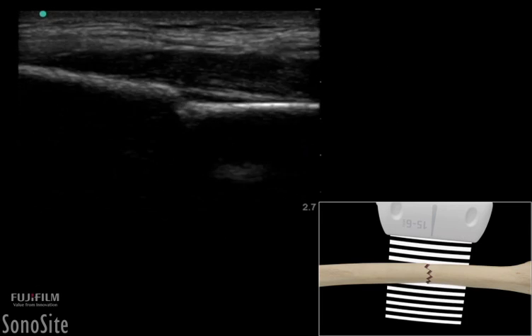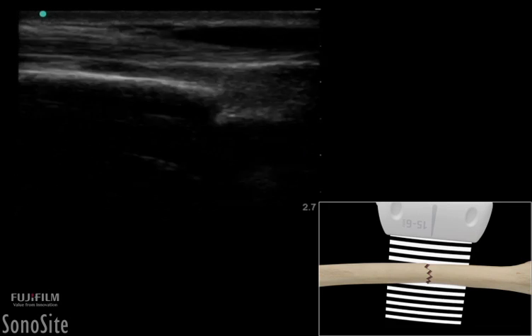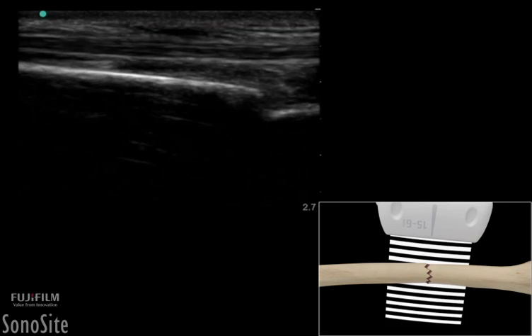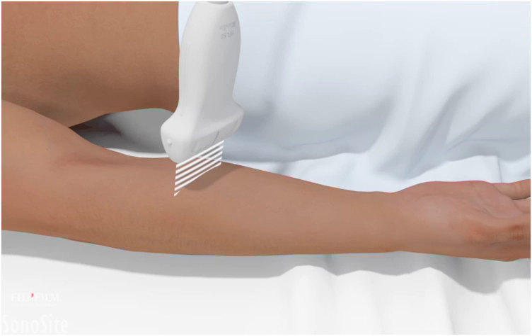A linear array transducer with a musculoskeletal exam type is used to perform an ultrasound examination of a long bone fracture. The patient is in a comfortable position to allow access to the injured area.